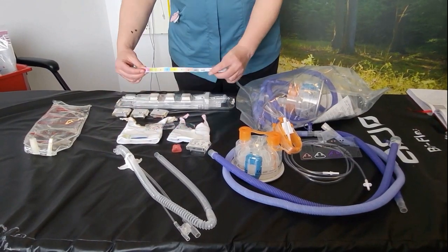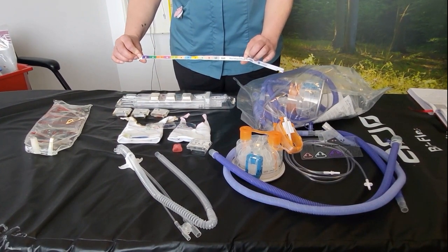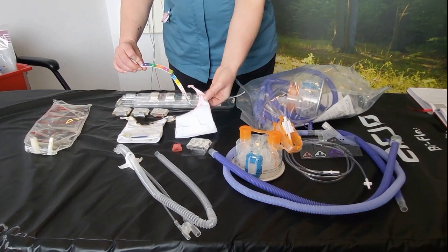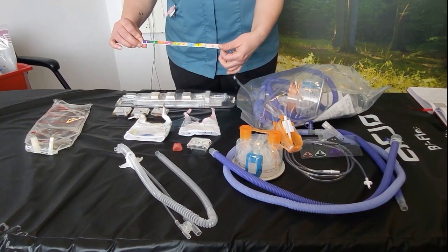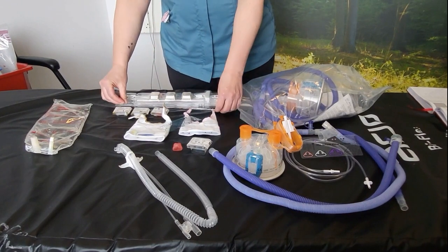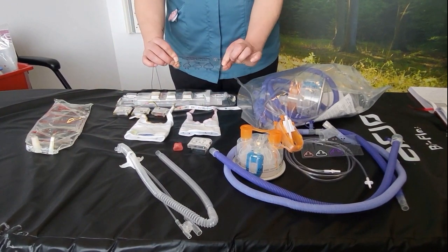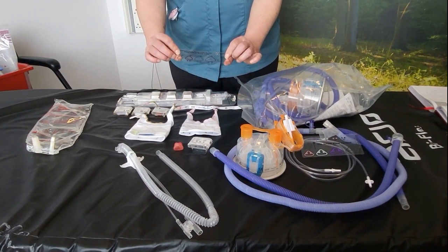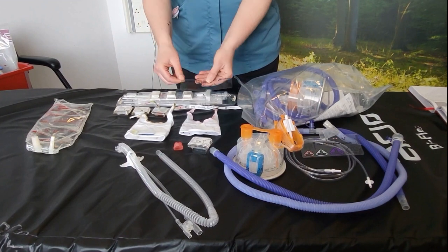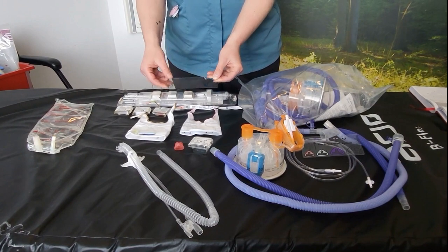In order to size for the correct bonnet you'll use one of the colour coded infant flow tape measures. You'll also need to use the infant flow nasal CPAP system prong and mask sizing guide, so you can hold it against the child's nose and nostrils to work out what size nasal prongs or masks you require.